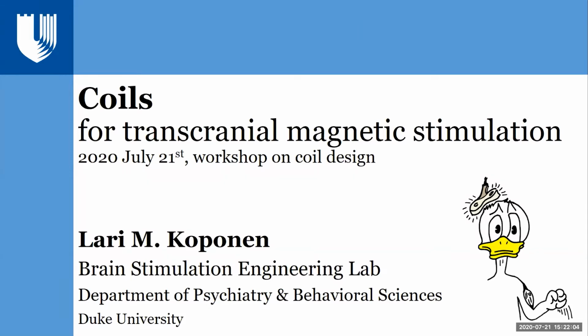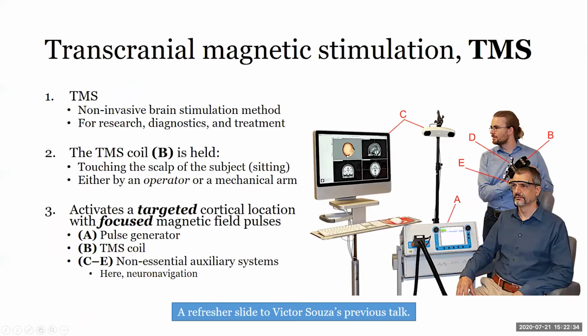But basically, my presentation is filling in some of the gaps, or adding details to some of the gaps you saw in the last two presentations. So I'm here to tell about the method improvements for the optimization of coils for such designs as the meshes that Rasmus Tedder was showing with his tools, and then Victor, of course, for the TMS application. So I can hopefully skip much of the explaining of the application part.